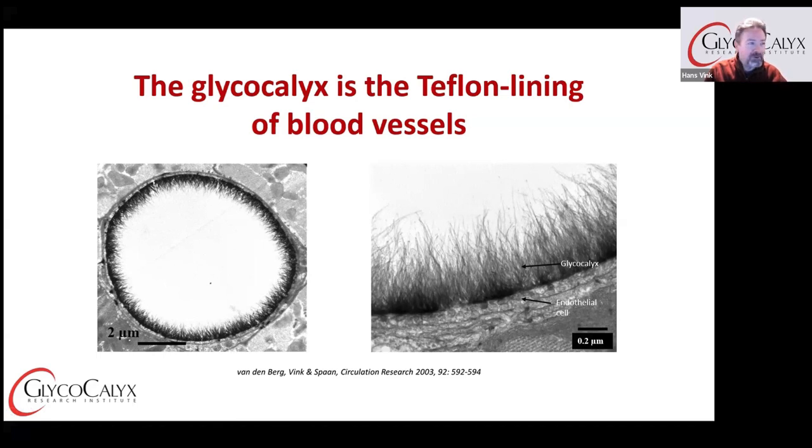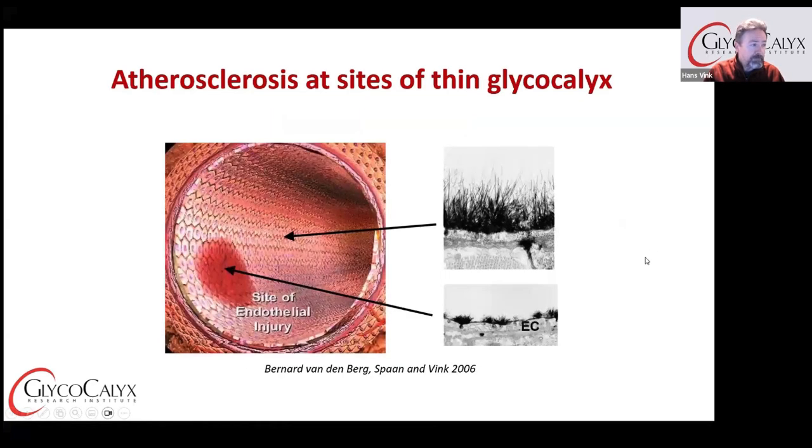So that really helped to show people there's something in that space and allowed us to do some more experiments to see what the functional implications are of having a glycocalyx, or damaging glycocalyx by exposure to risk factors or different enzymes like heparinase or hyaluronidase. We're going to show a few examples, if that's okay with you, of what happens in those experimental settings.